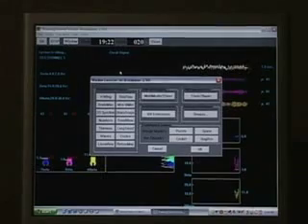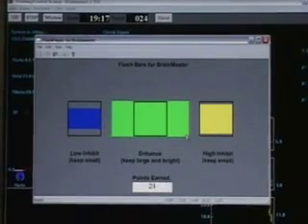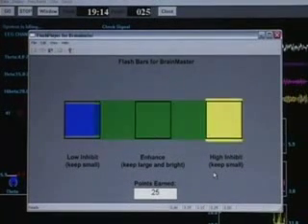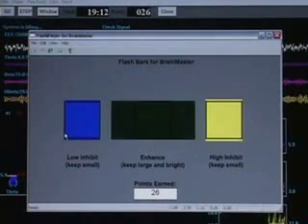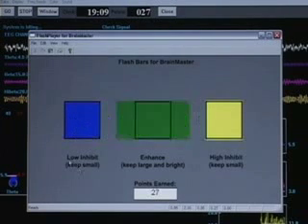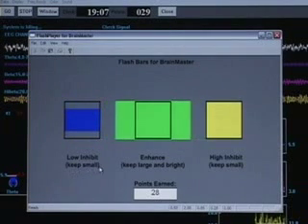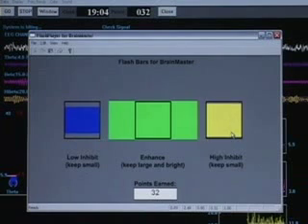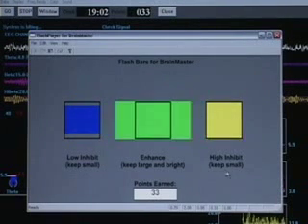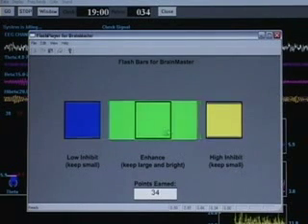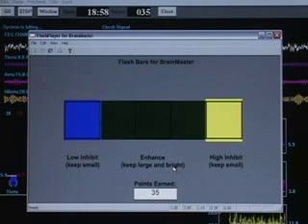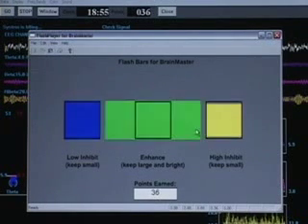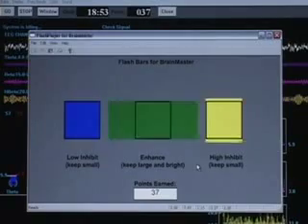In addition, now we can use the flash games. We press the window button and we see that flash player is one of the choices. We press flash player and the flash player immediately comes up running the bars game. We see a bar for theta — it says 'low inhibit, keep small.' We see the bar for high beta — it says 'high inhibit, keep small.' We see the enhanced bar in the middle — it says 'keep large and bright' — and we see that these bars are moving in an appropriate fashion.